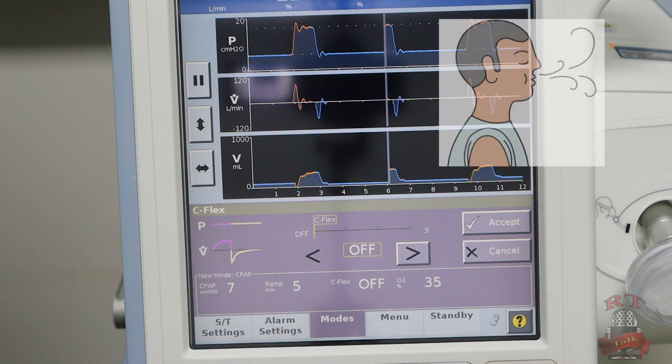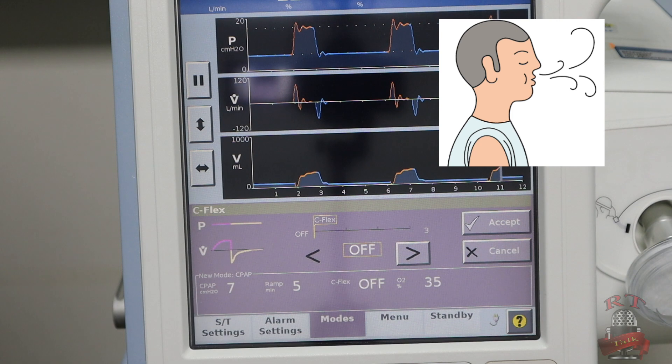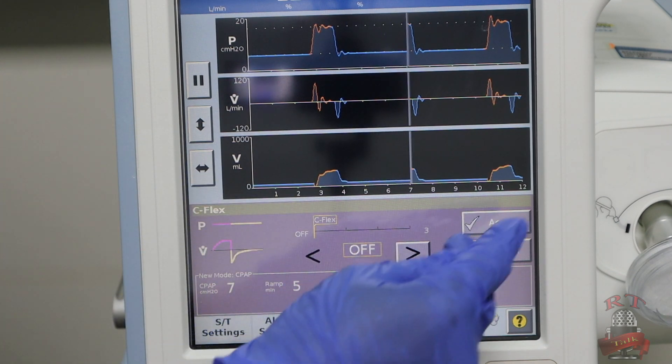When the patient is exhaling, the CPAP pressure will go a little bit down, so it will let him exhale with no hard time. But if you are handling an acute patient, you will just keep it off.